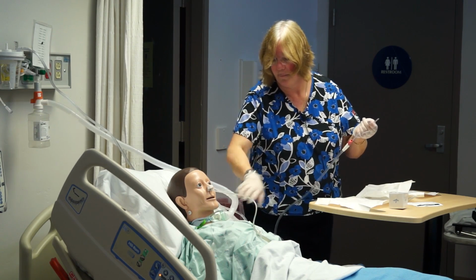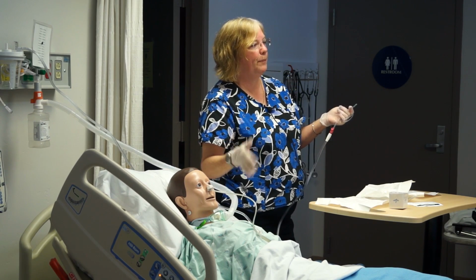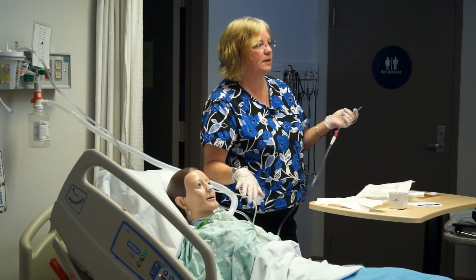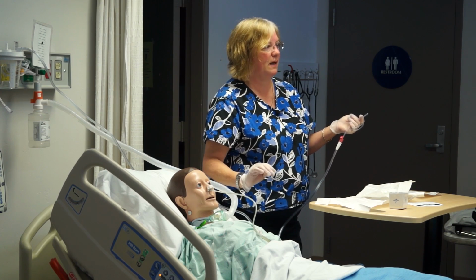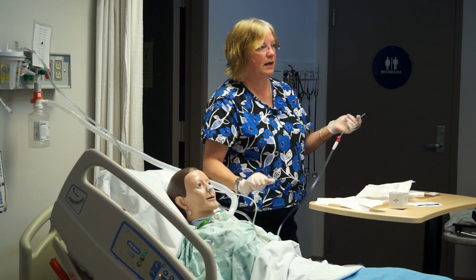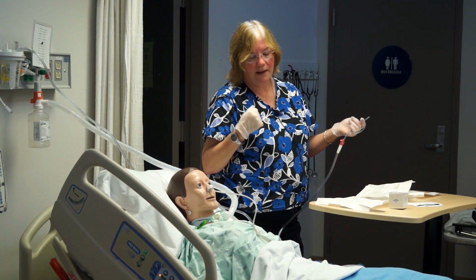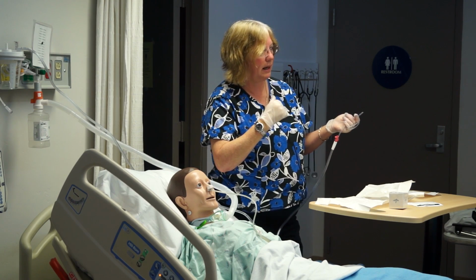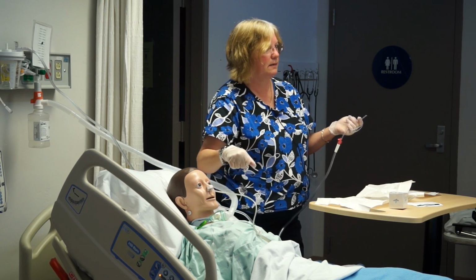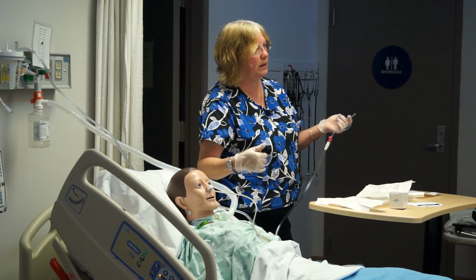Look at my patient. My patient has a bedside monitor. This patient should have a continuous O2 sat on. They're on oxygen, they have a trach, so they should have bedside oxygen saturation available for you to assess. Often what I will do is leave my stethoscope hanging on my neck and reassess the lungs. We can usually go down 2 to 3 times is all we can do.